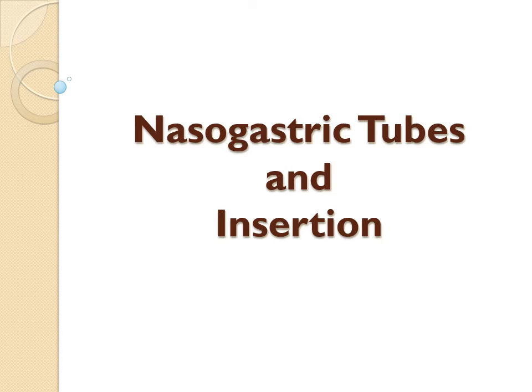Today we're going to be talking about nasogastric tubes and their insertion. We're experimenting with this audio so that you'll be able to review it online a couple of times before you come into class, so that we can spend more time actually doing the practice of the skill in our practice lab. The nasogastric tube is usually placed for one or two reasons into the GI system.